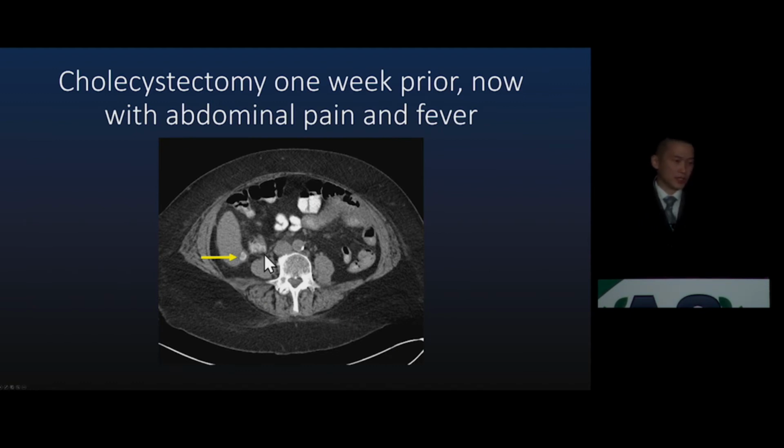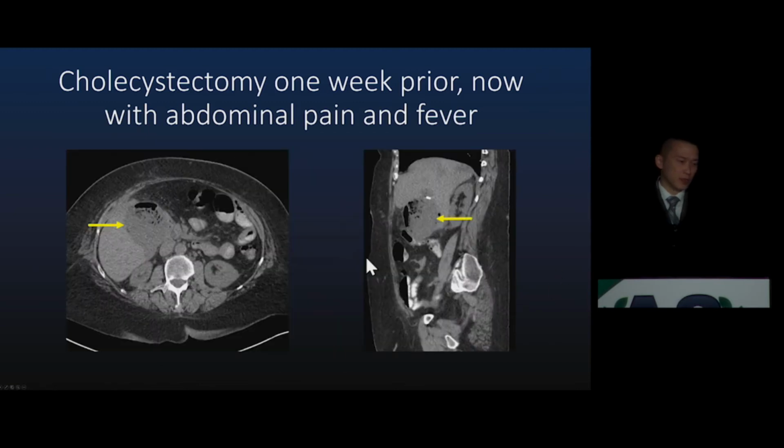Different patient. Again, we see a dropped stone. This patient is presenting with abdominal pain and fever. When we look up a little bit higher in the gallbladder fossa, we see this large collection of gas, fluid, and some frothy material.